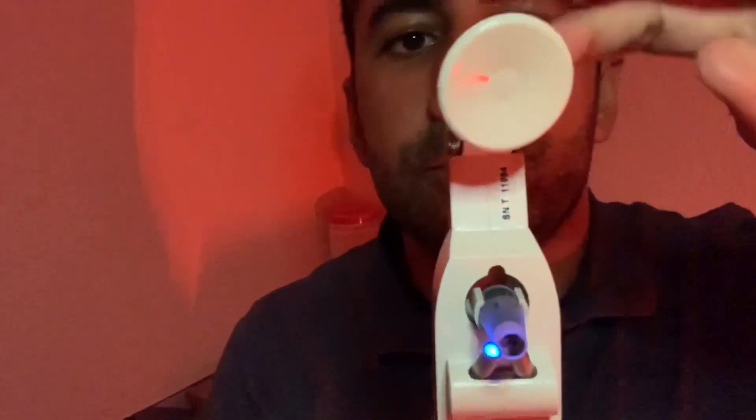You'll feel the headrest just press delicately against the forehead, and I may just move this forward a little bit and use my hands for support as well. Okay, looking straight — blink again — and we'll just bring it against the scale.